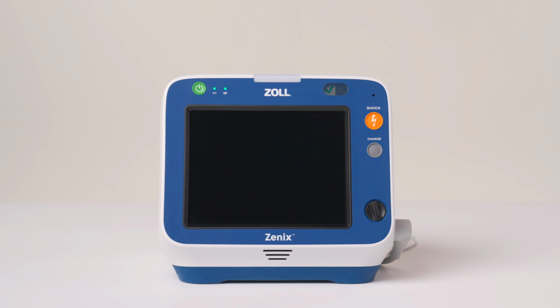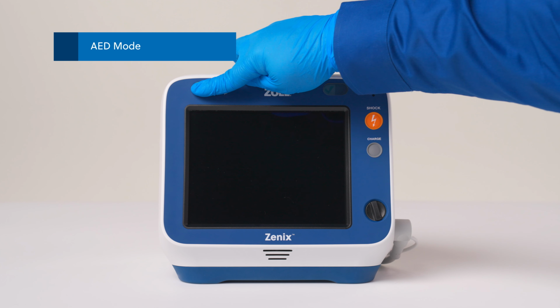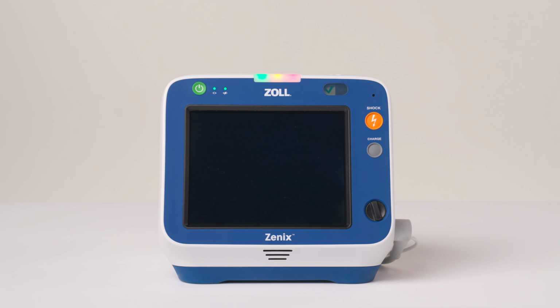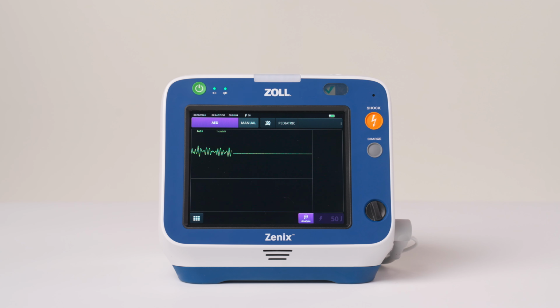Now, let's review the defibrillation features in AED and manual modes on the Zenix defibrillator monitor. If so configured, your Zenix device will power on in AED mode and guide you through CPR cycles. Stand clear.